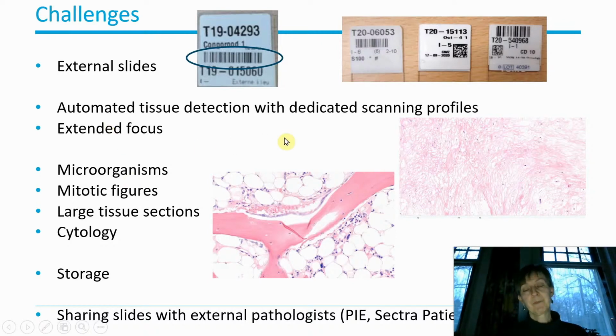Then there are still some issues with automatic tissue detection, especially if there is not much contrast in the slide, and it will be very helpful if the scanning profiles really can be automatically chosen by the software that are needed for these specific cases.